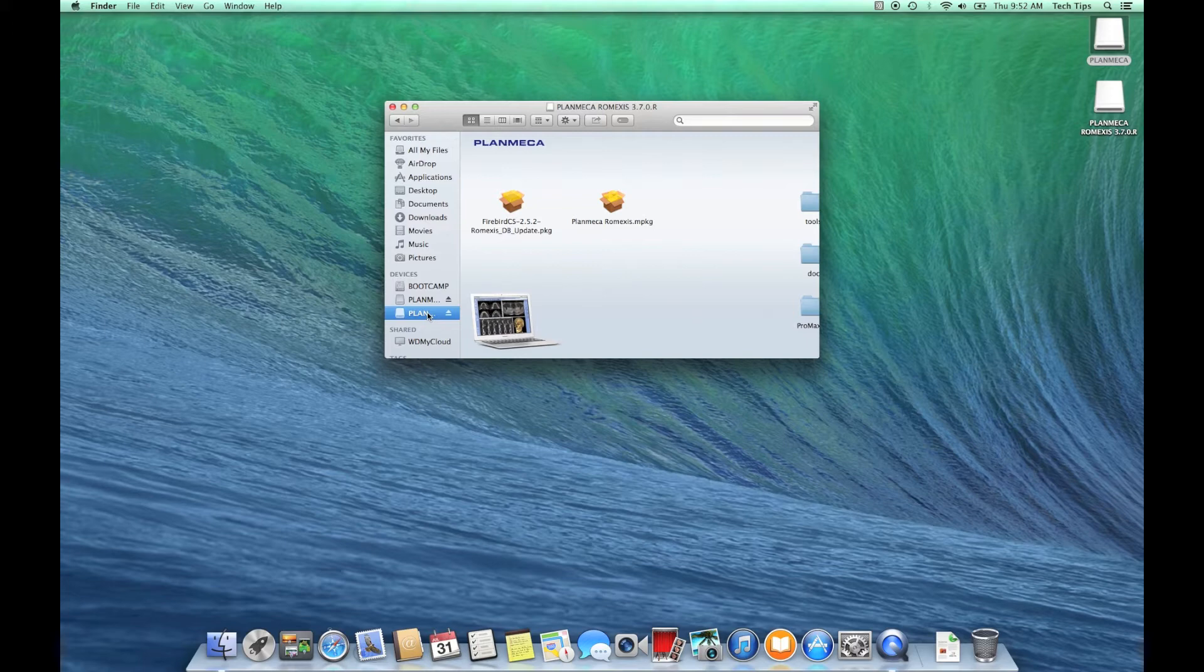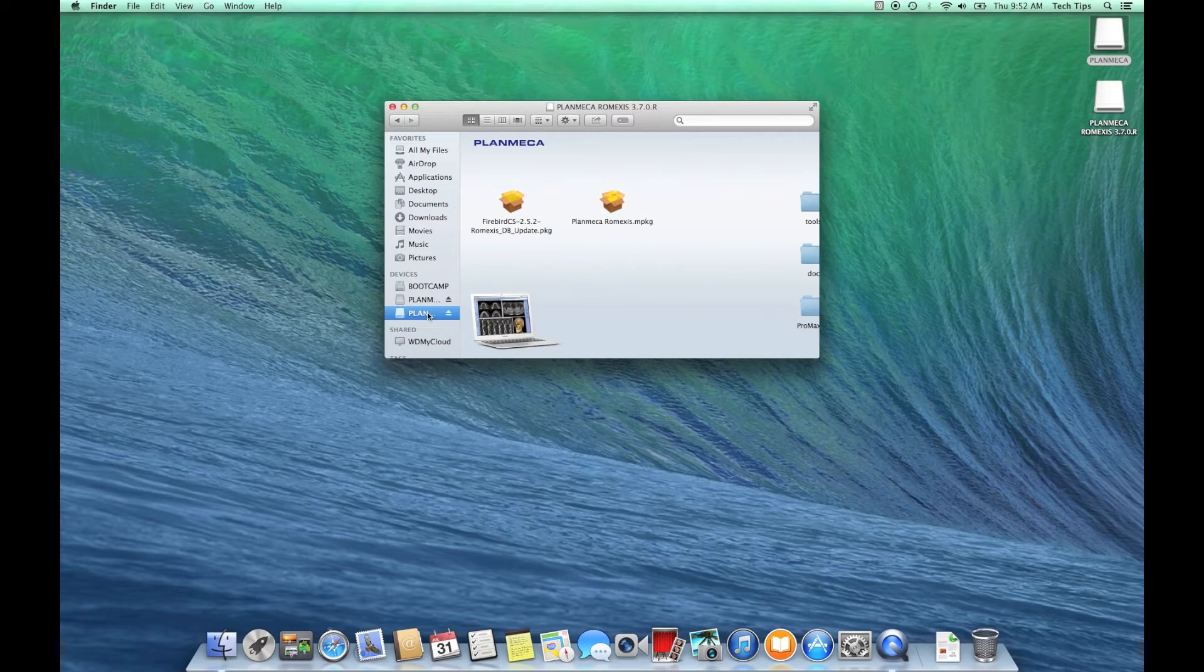server computer. If you're going to install Romexis on a server computer and you wish that computer to act as the server, you're going to need to install something called the Firebird database engine. Installing this is kind of like the equivalent of installing a SQL engine in Windows.